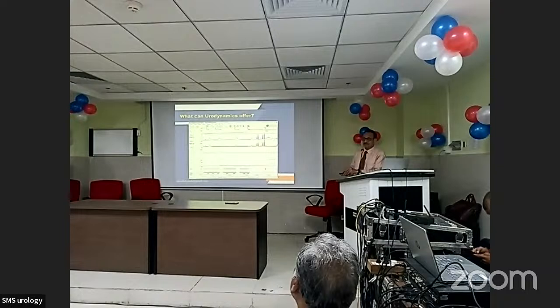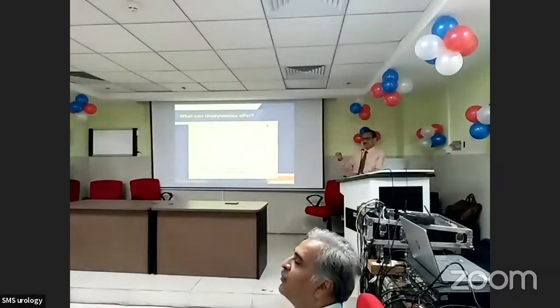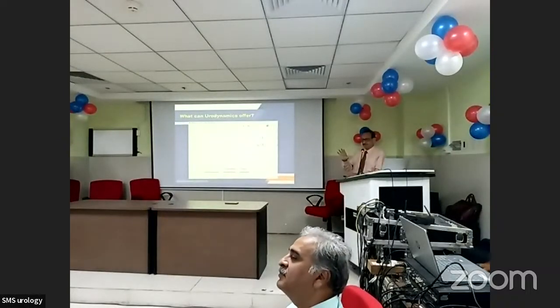We have to see the EMG activity also at that time, to see that the patient is not suppressing that contraction to prevent incontinence. So label this as normal. But remember, the patient is not having symptoms of urgency at that time. Asymptomatic is asymptomatic. She has no urgency, so she has no desire to contract the pelvic floor at that time.